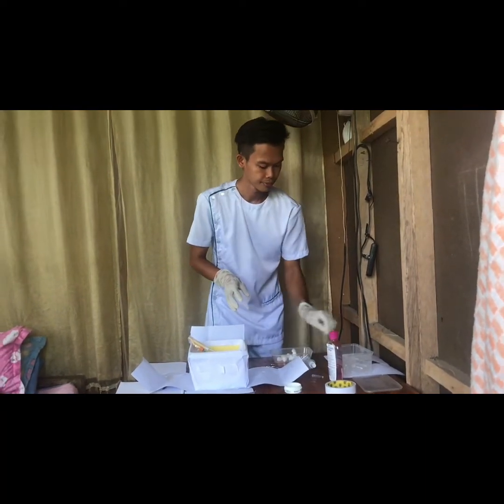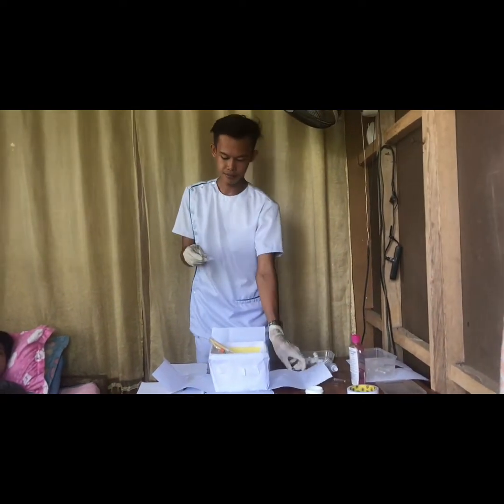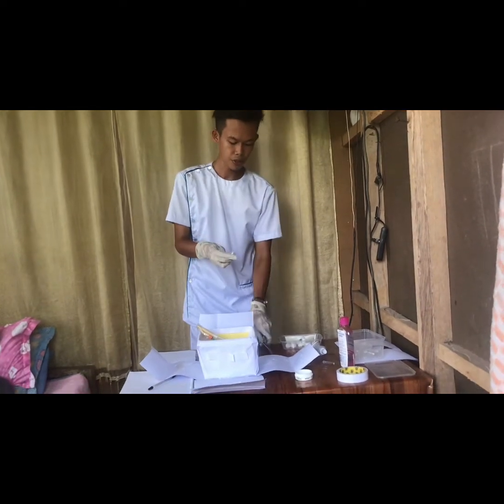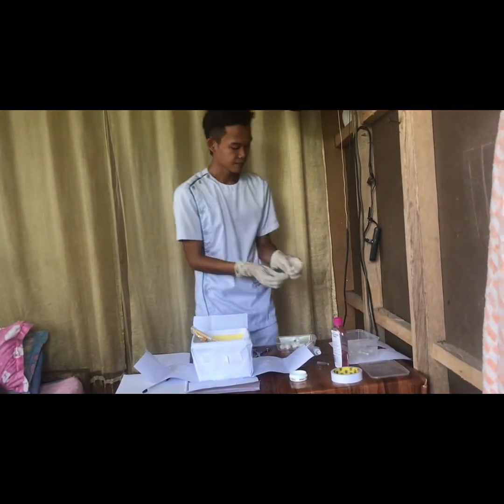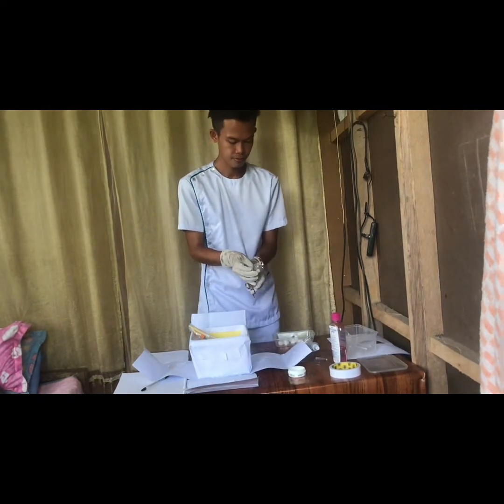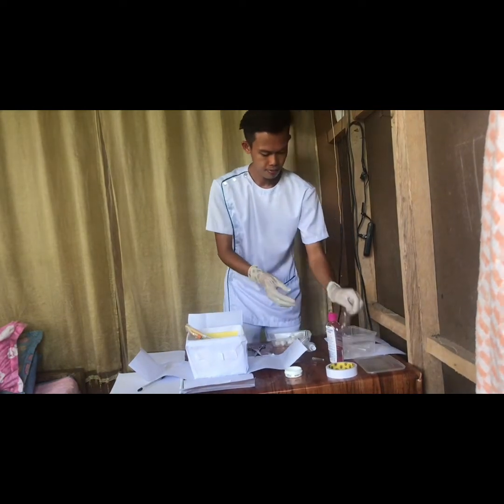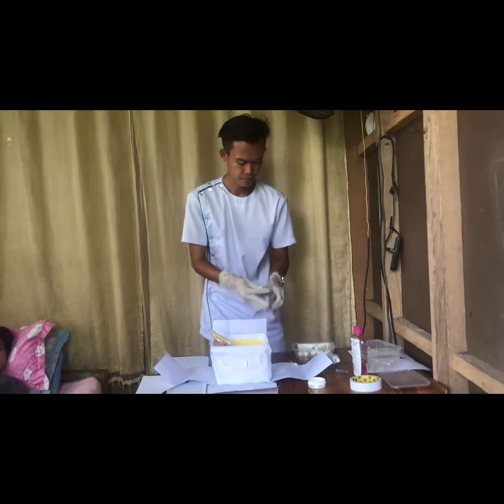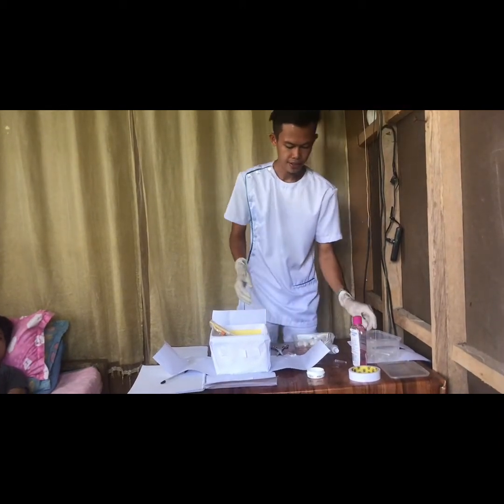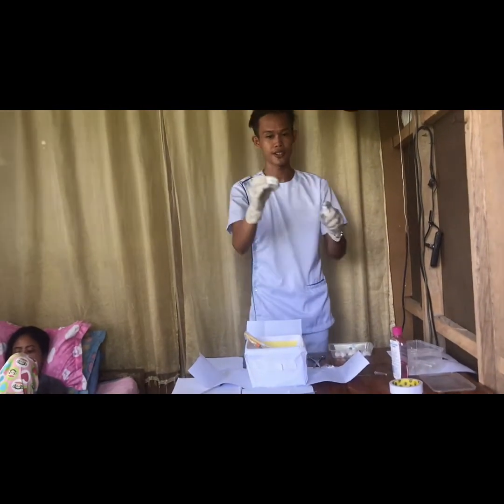Okay, so the next thing we're going to do is open the alcohol swab immediately, one by one. We're going to use 3 of the alcohol swabs. Okay, already done. And then we're going to spray a little amount of lubrication to this cup.